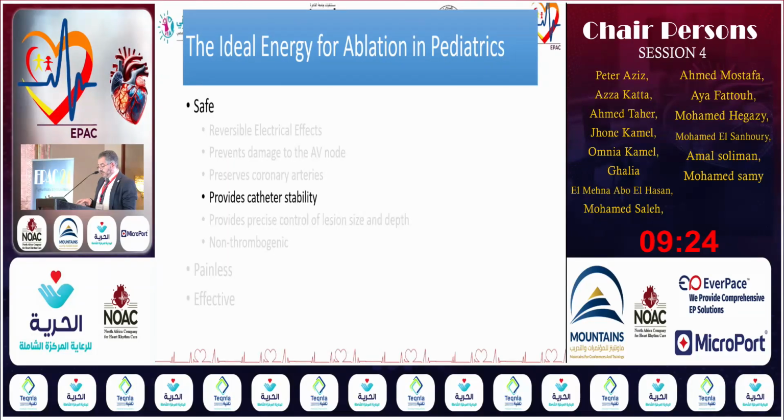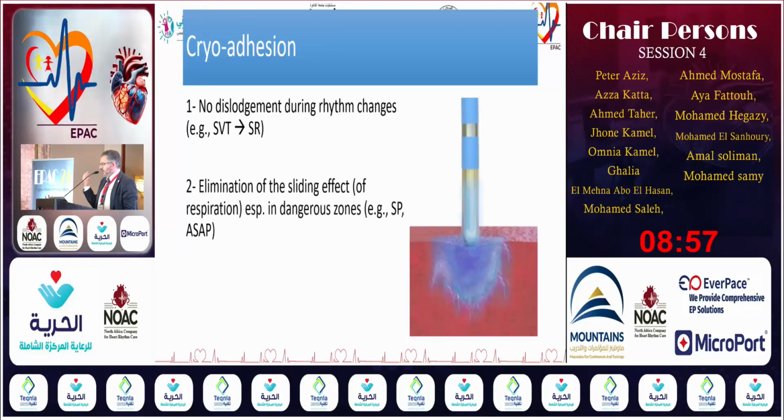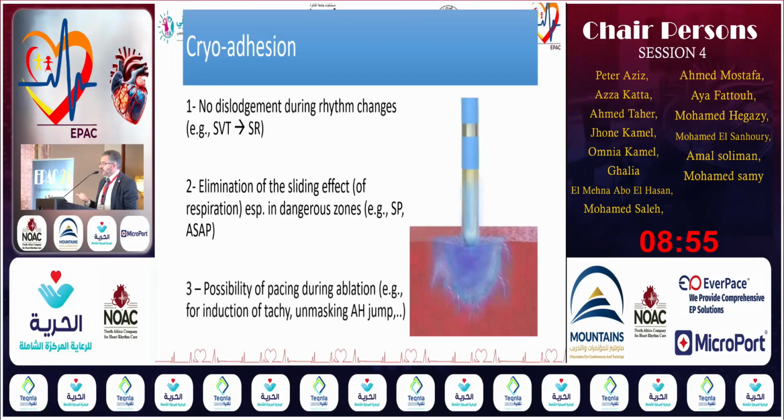Now, one of the other interesting features about cryoablation that contributes to safety is the cryoadhesion. Interestingly, once the catheter temperature drops to cryomapping level, it sticks to the tissue. It no longer moves. So once you are at a good spot, both in terms of safety and efficacy, you are sure that no matter how deep the patient breathes, no matter how the heart beats, and even if the tachycardia terminates or you decide to pace to study the effect of pacing, it won't change.